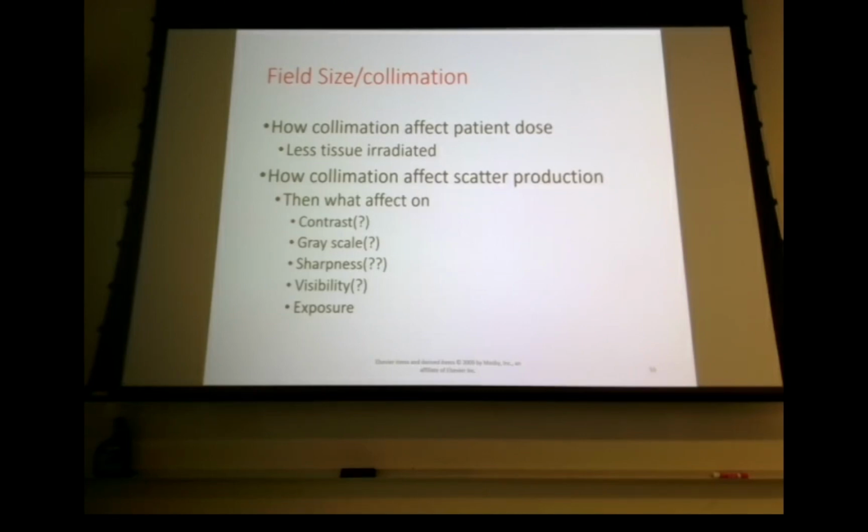Somebody posted it was a beautiful odontoid, but they included from ears to eyes to thyroid, right? So how much of that do you need? You know, an area about that big, about as big as 3 to 4 fingers is about all you need. So it becomes more of a radiation safety thing for the patient, and what do you need to try to keep your radiation dose to?